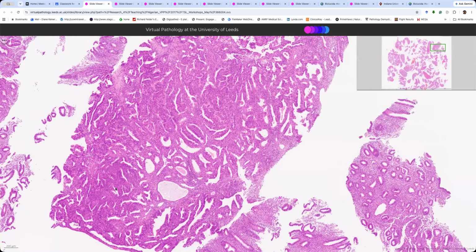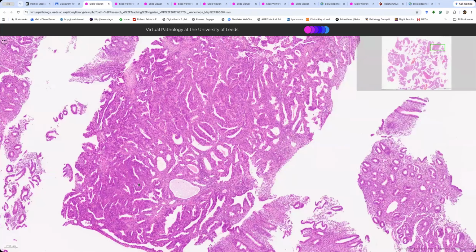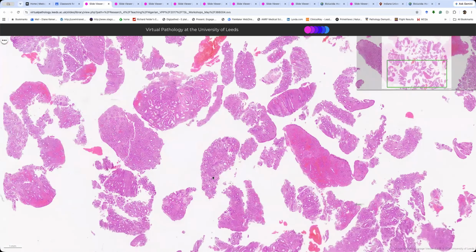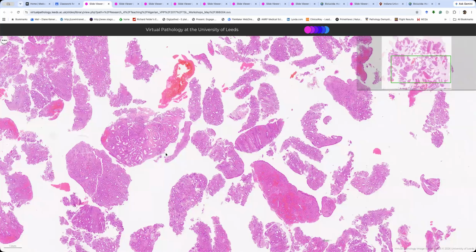You've got proliferations here. All right, good. So yes, atypical hyperplasia because it's less than 2 millimeters. Great. So we've got areas that look like carcinoma, but they're less than 2 millimeters. So I usually say atypical hyperplasia at least with some areas approaching endometrioid carcinoma that do not yet meet the criteria.